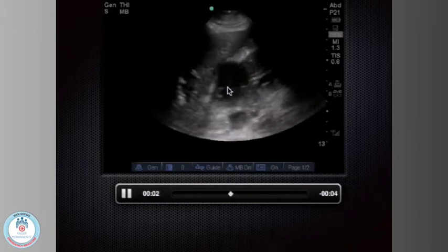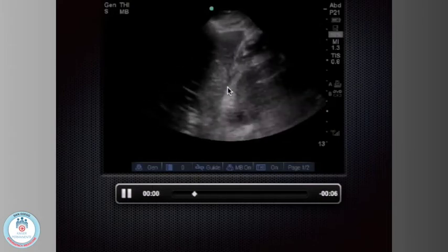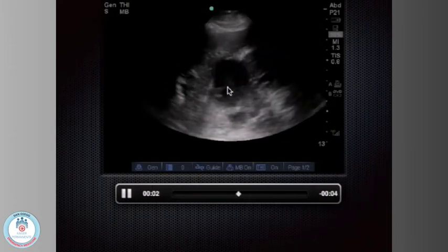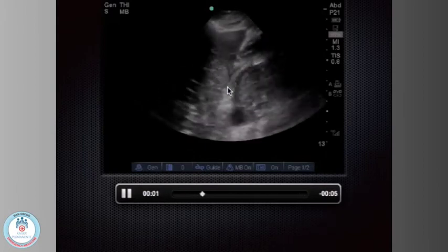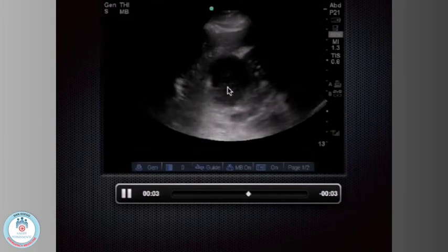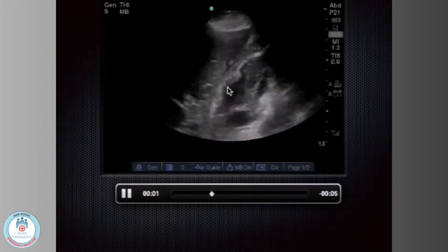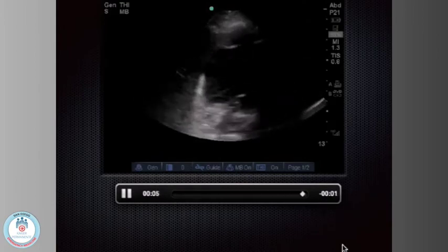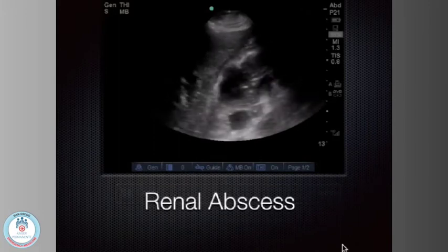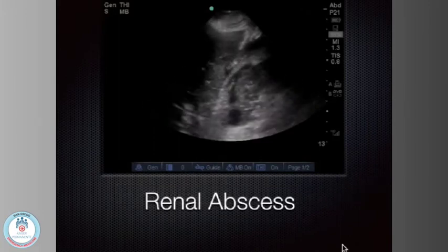That's a renal abscess. A renal cyst is spherical in all dimensions, anechoic, jet black as you fan through it. Renal cyst, very common, kind of not that interesting. But a renal abscess, when there's actually all this hypoechoic debris sitting in there, is kind of rare, always interesting, lots of fun. Bam, you see it up there? That's all that renal abscess coming on the top of the screen there.